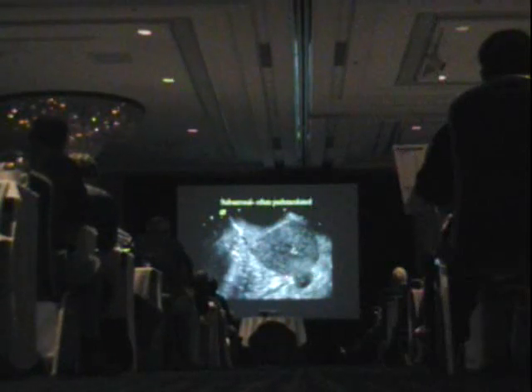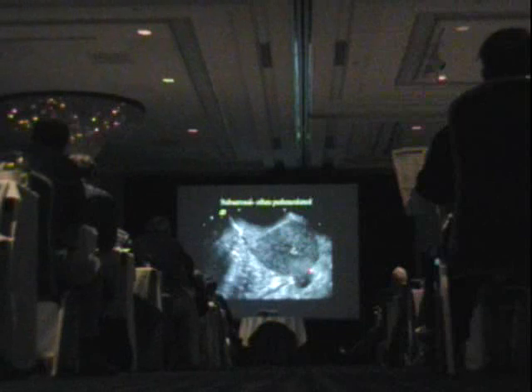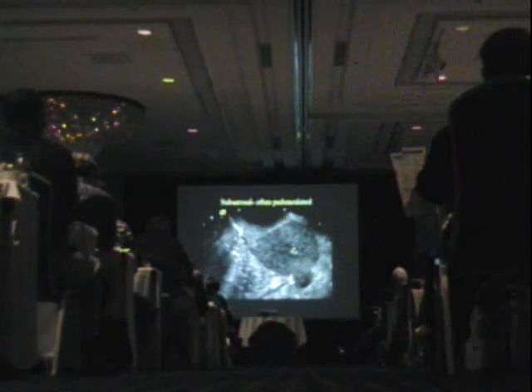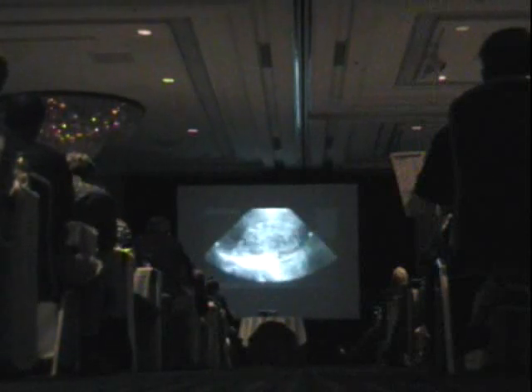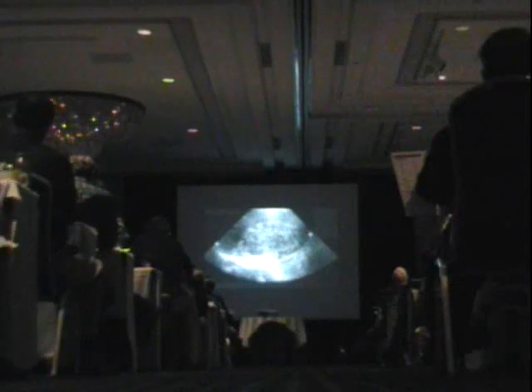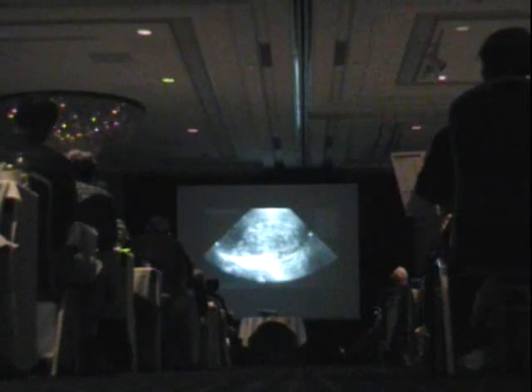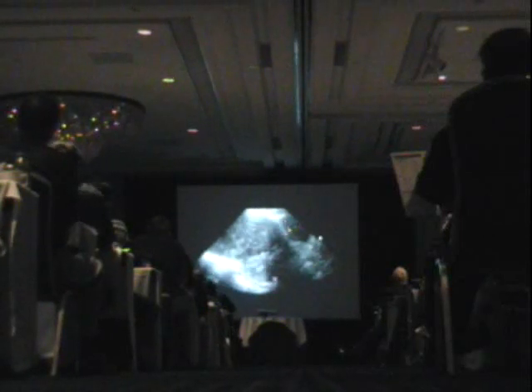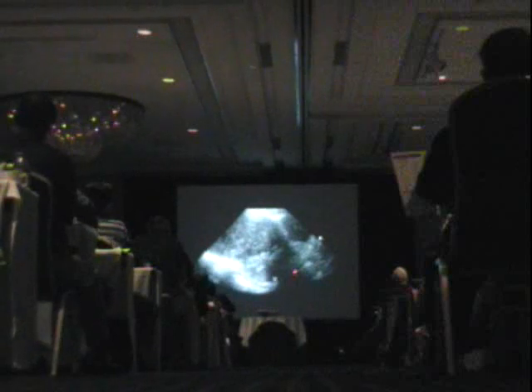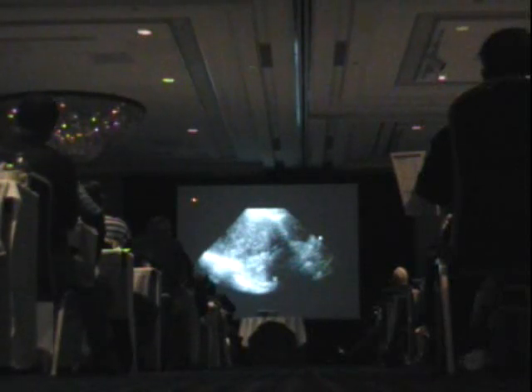Another location for a fibroid are these subserosal fibroids, which hang off the serosal surface and are typically asymptomatic unless they're big enough to push on bowel or bladder and cause symptoms from mass. Here's a patient with a big fibroid uterus, and the sonographer came out and said, here's the uterus measurements, but I can't really tell where the fibroids are, but you need to be aware that there was something else down here. This is a transabdominal image. And see that here's the bladder, this is the uterus down here, and the whole thing that was measured was a very, very big subserosal fibroid.